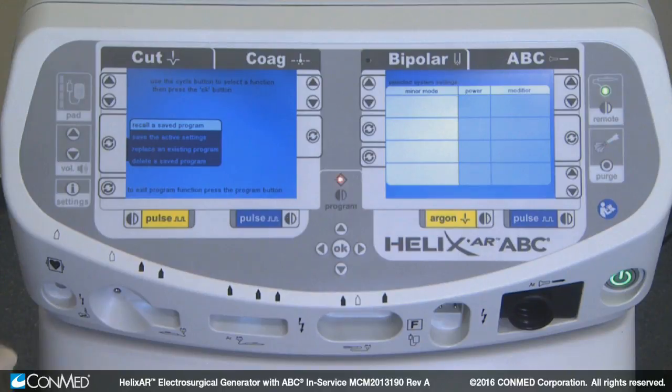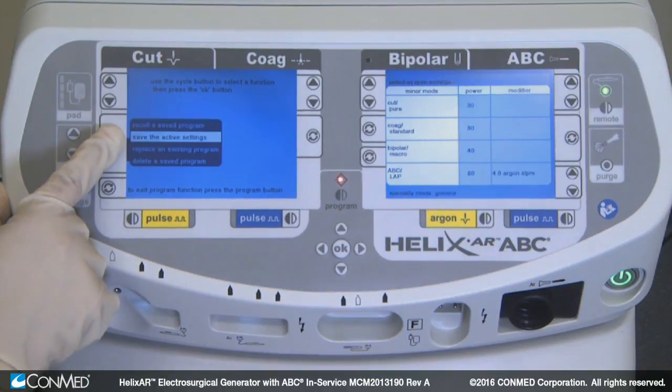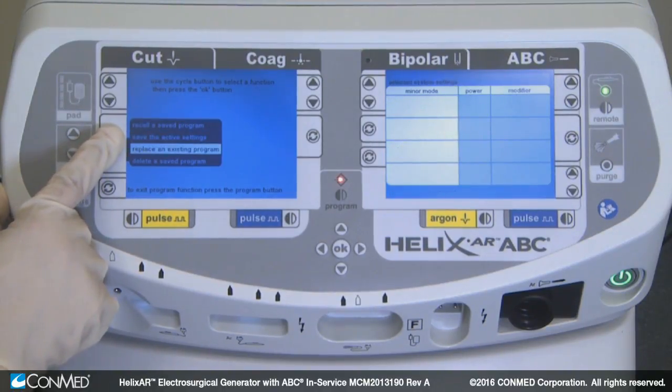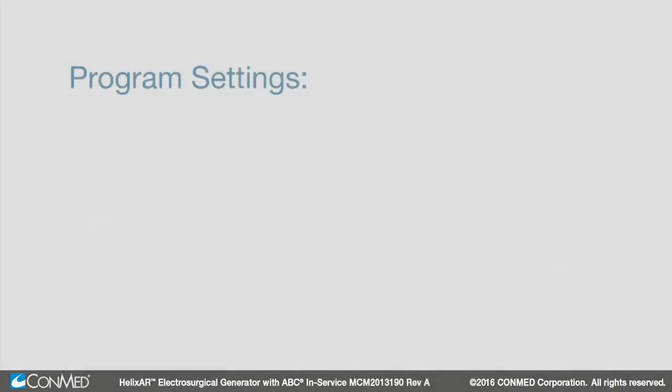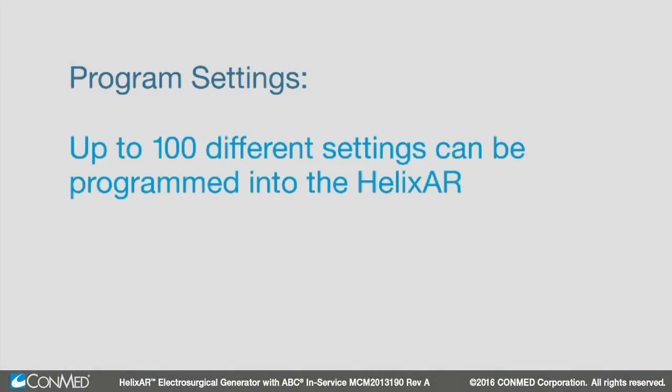By using the cycle button, you can recall, save, replace, and delete the program. Up to 100 different settings can be programmed into the Helix.